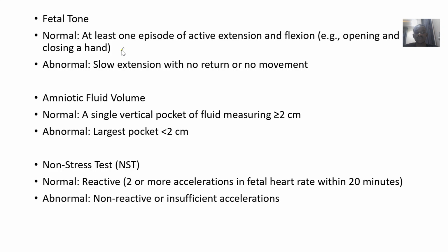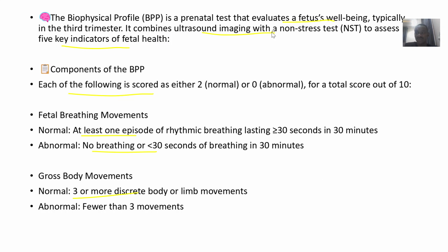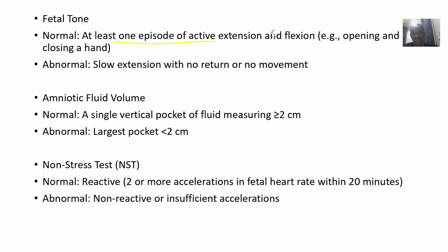Fetal tone, right? So if it is normal, there is at least one episode of active extension and flexion. You're looking at the muscle tone. Is the baby weak or is the baby active? You understand? Abnormal is slow extension with no return, or no movement.